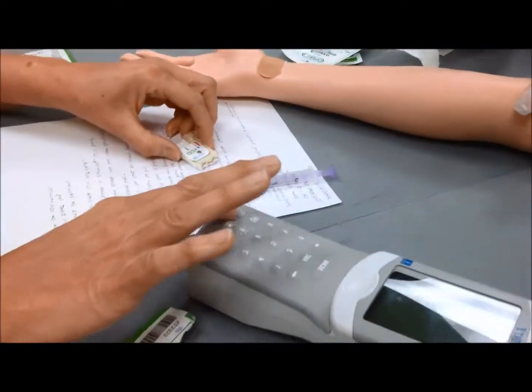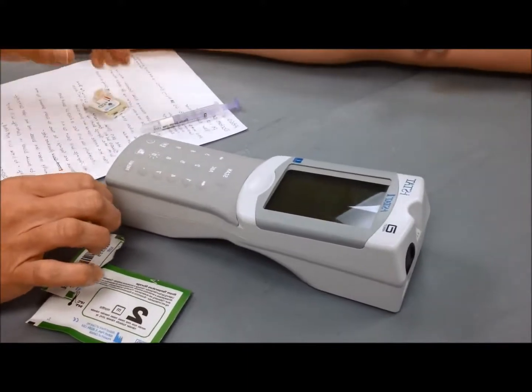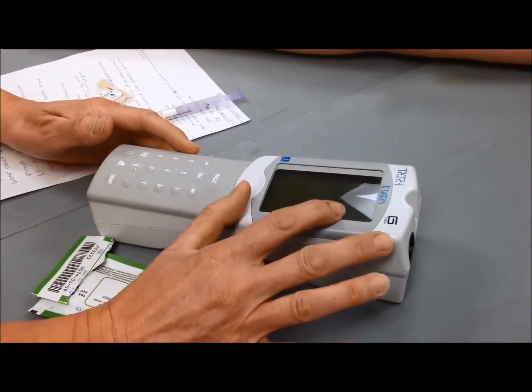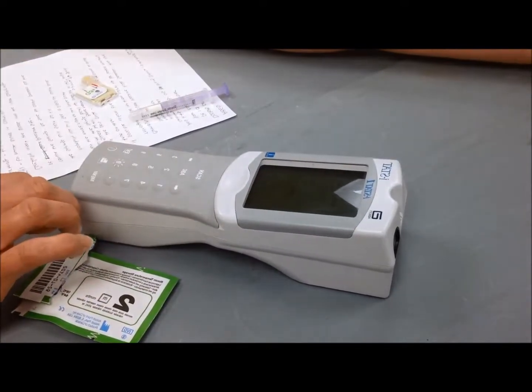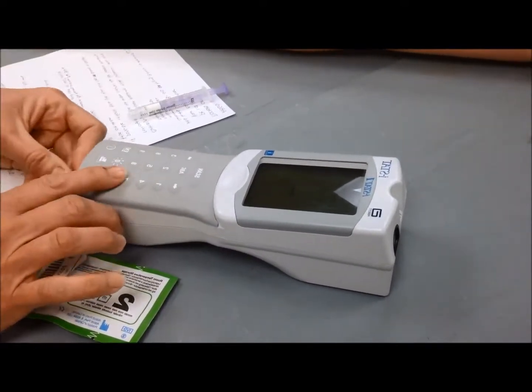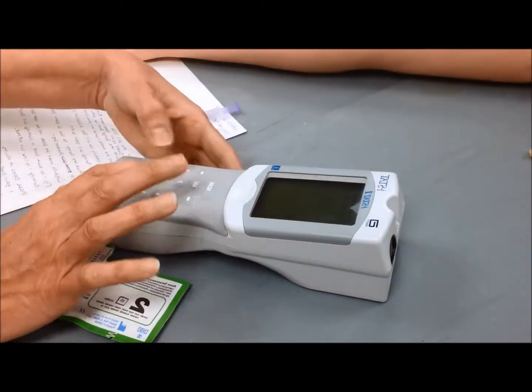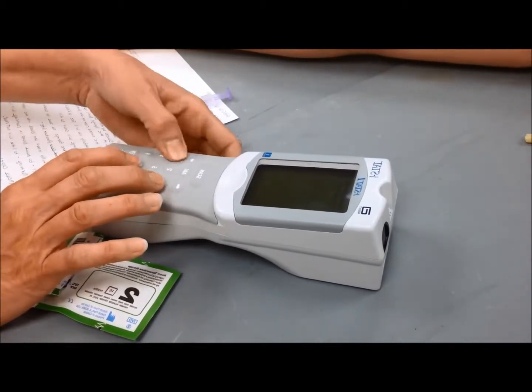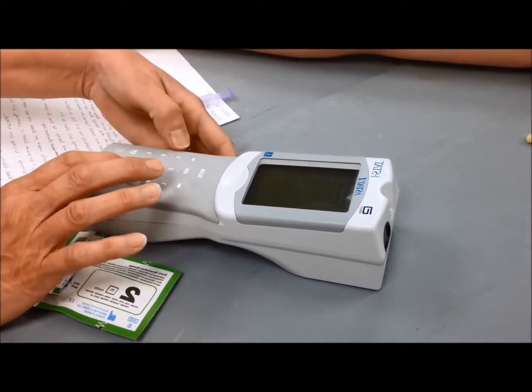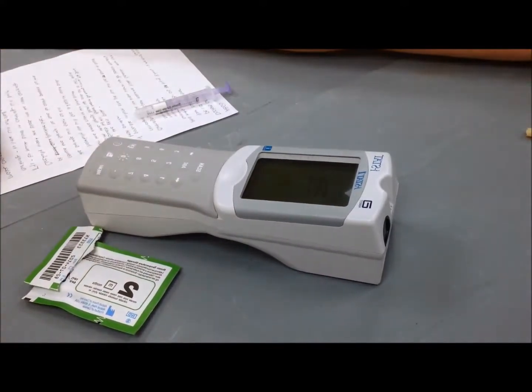Put it in, turn the iStat machine on. It says first, last result to iStat cartridge. You'll press iStat cartridge. It says insert cartridge. Operator ID. Enter again. Repeat putting your ID until it tells you to do something else. It's identifying the cartridge.